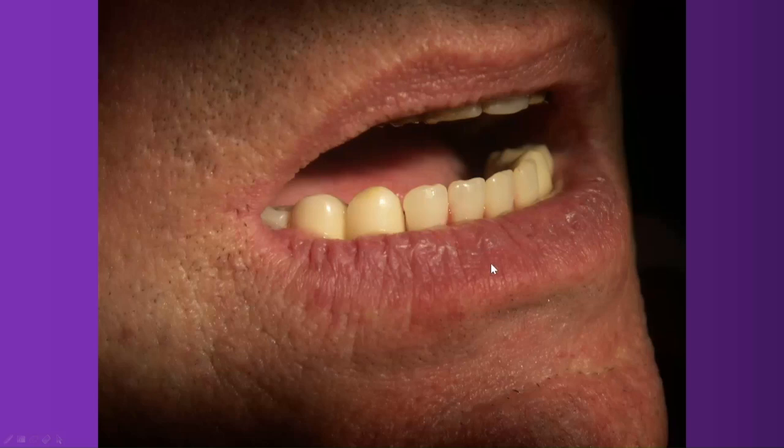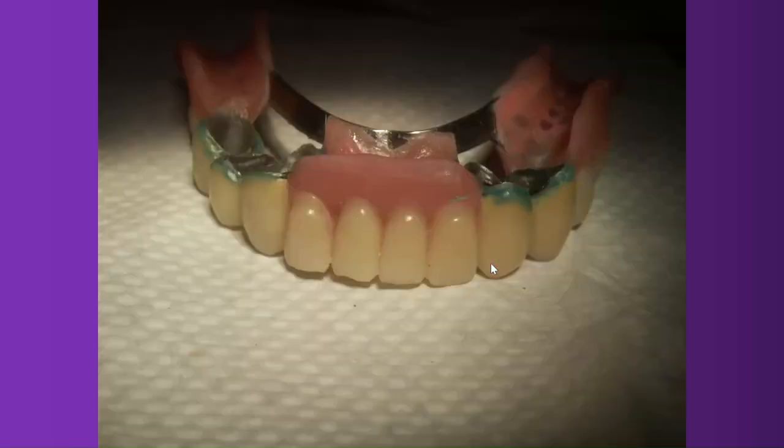And that was the wax pattern, and now the final denture. I placed a little bit of green wax there because I was afraid that once I cemented, some cement could get in between the fixed and the removable parts. So I wanted to isolate somehow the two components, primary and secondary, to make sure that no cement would get in there. Maybe it was overkill, but I wanted to make sure at that time. Afterwards this wax, of course, was cut.